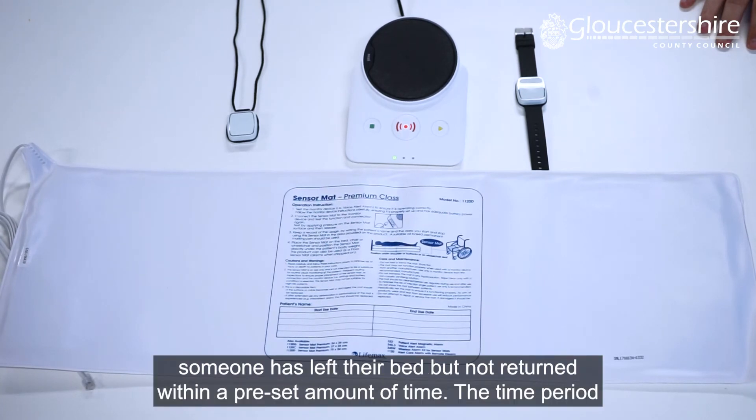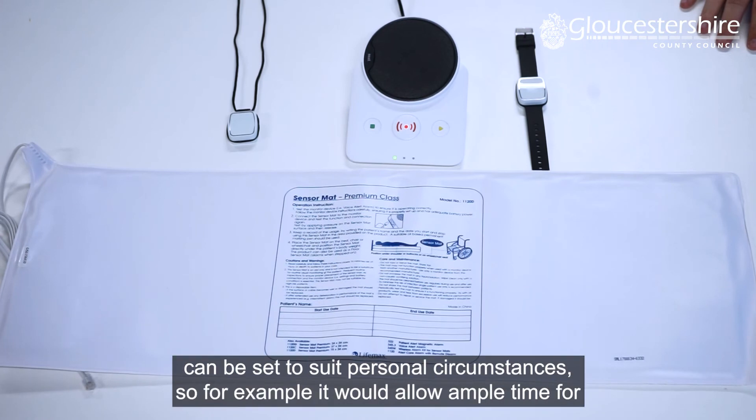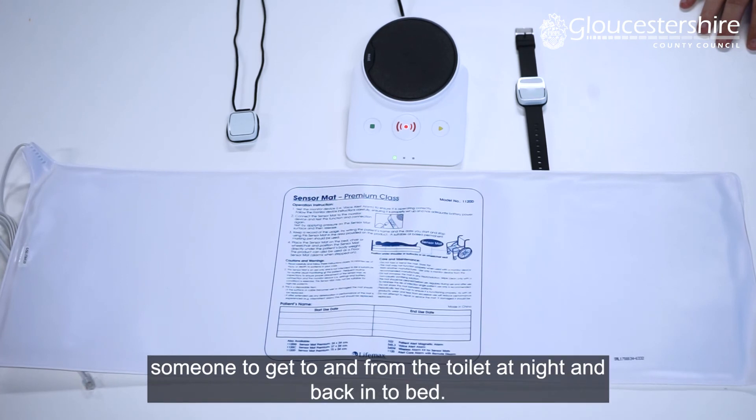The bed sensor is wirelessly linked to the Lifeline unit and will send an alert that someone has left their bed but not returned within a pre-set amount of time. The time period can be set to suit personal circumstances — for example, it would allow ample time for someone to get to and from the toilet at night and back into bed.